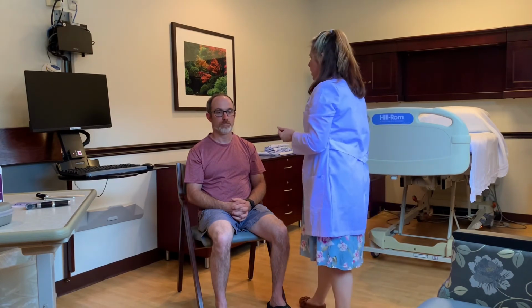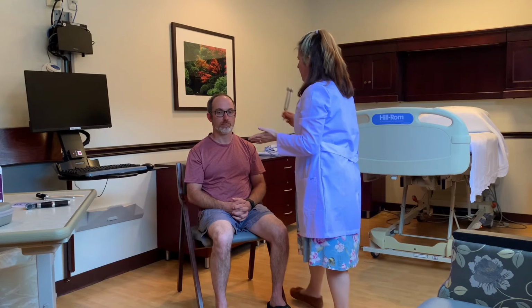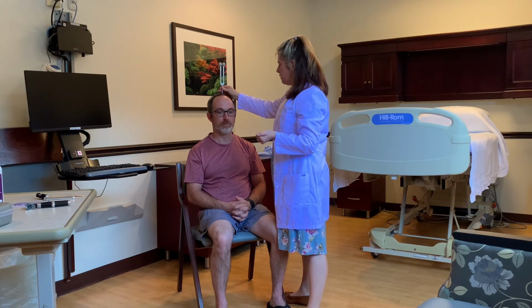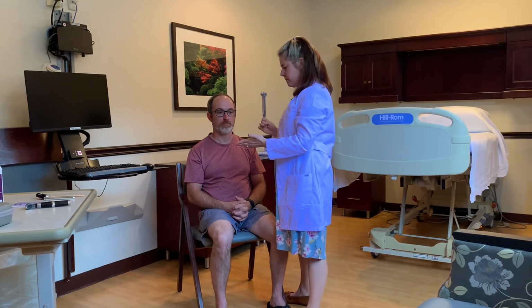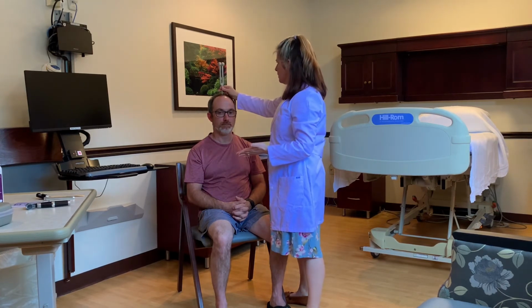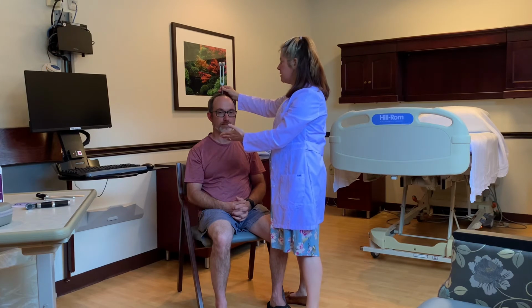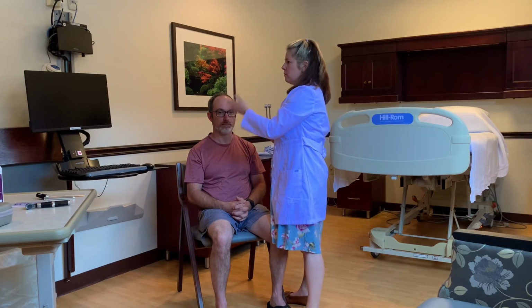Weber test, which is looking for lateralization. So I'm just going to strike my tuning fork here, and I'm going to put it on the crown of your head. Can you hear that? No. Okay, let me do it again. Yes. Okay, and so we're looking to see if it lateralizes to one ear or the other, and if it does, the ear that it would lateralize to would be the one that we would be concerned with.